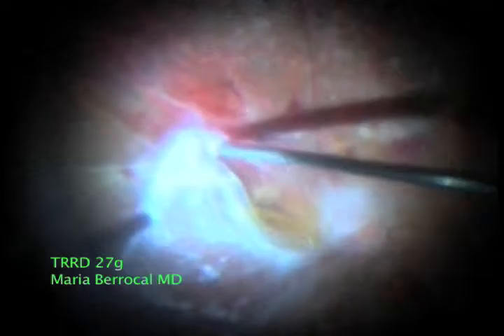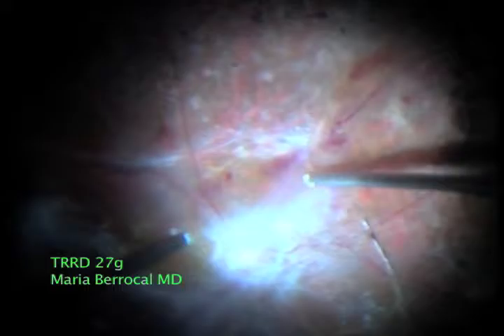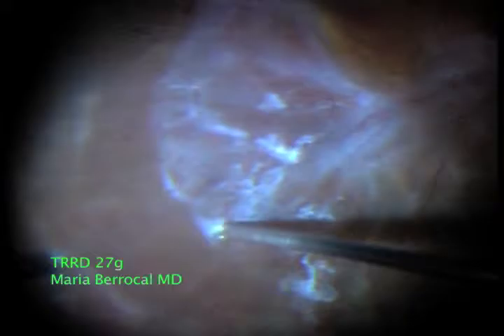As we can see, the retina looks very ischemic and there are large sheets of fibrous tissue covering all of the posterior pole. Severe ischemia is present.